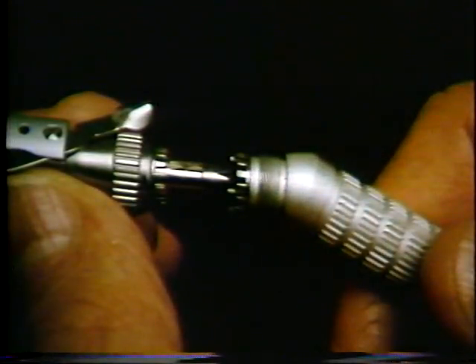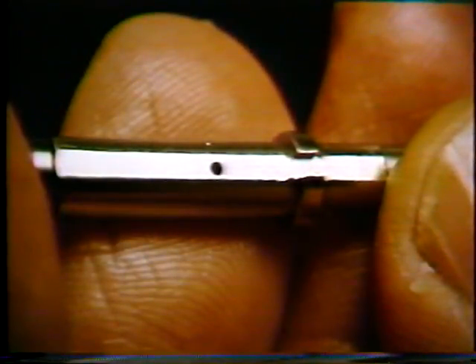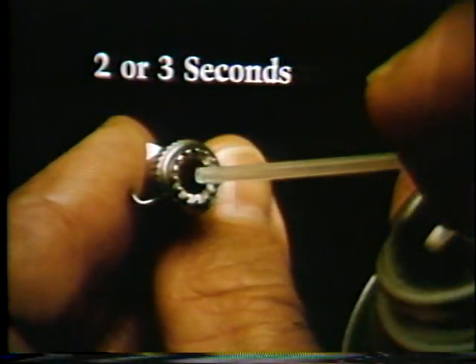Remove the contra-angle from the attachment. Then pull the drive shaft out of the head of the contra-angle. There is a small black washer on each end of the drive shaft next to the gears. Both of these washers should be sprayed for a couple of seconds with spray-a-day. You should also spray the hole at the middle of the shaft and into the back end of the contra-angle for 2 or 3 seconds.